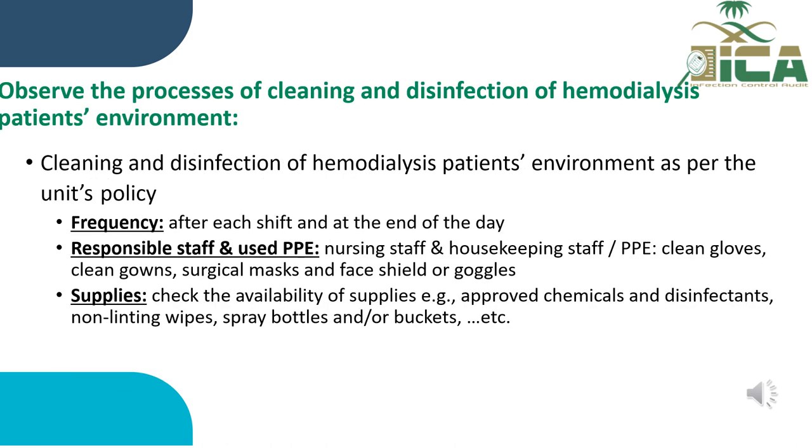Observe the process of cleaning and disinfection of the hemodialysis patient's environment. Cleaning and disinfection of the hemodialysis patient's environment is done as per the unit policy. Frequency: after each shift and at the end of the day. Responsible staff and use of PPE: nursing staff and housekeeping staff wear PPE, clean gloves, clean gowns, surgical mask, and face shields or goggles.